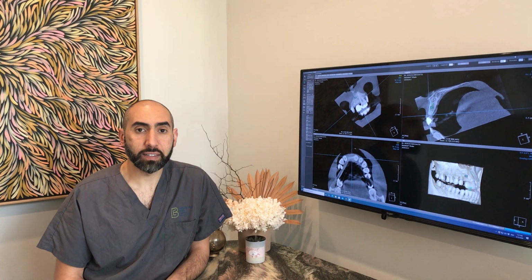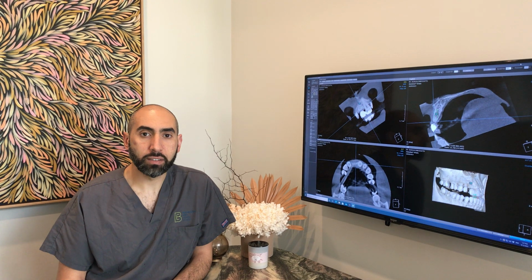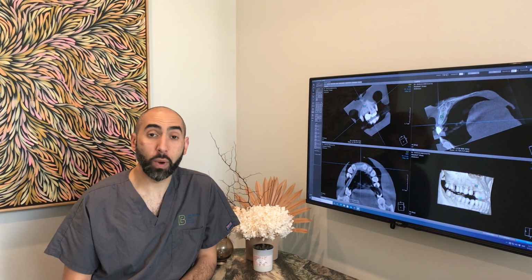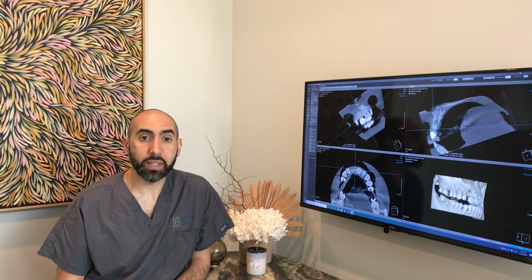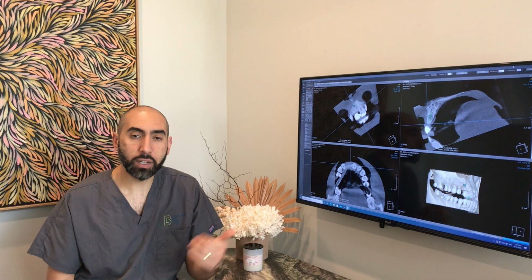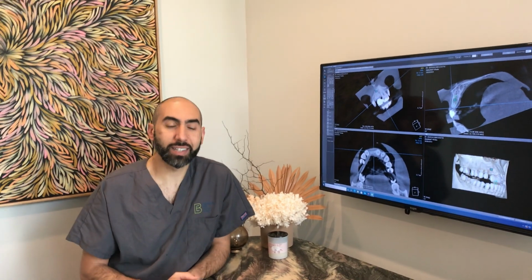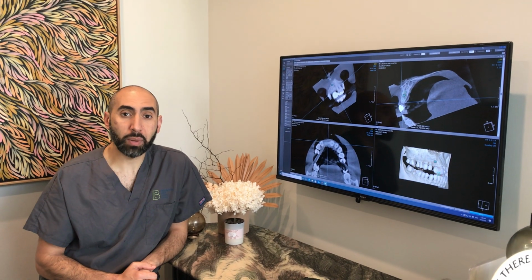With endo, I've found it really useful in terms of finding extra canals, knowing straight off the bat whether the tooth is 3 canals or 4 canals, and where they are and how I can access them. Really good for diagnostic purposes. Someone comes in with some pain, they don't know exactly where it is. You take a cone beam, the PA looks like it's absolutely fine. You take a cone beam, there's a massive PA lesion on the tooth that's hidden that you don't really get to see. So all those things have been really useful for me in adding value to my patients and being able to treatment plan on the spot.